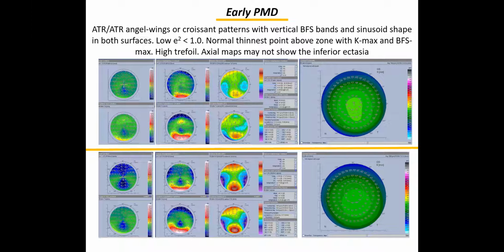of the cornea. Curiously, most post-refractive ectasia has this against the rule pattern and is not usually with the rule like in keratoconus. Keratoconus can get this pattern at the end. Pellucid gets this pattern very, very early. Keratoconus progresses very early in young people.